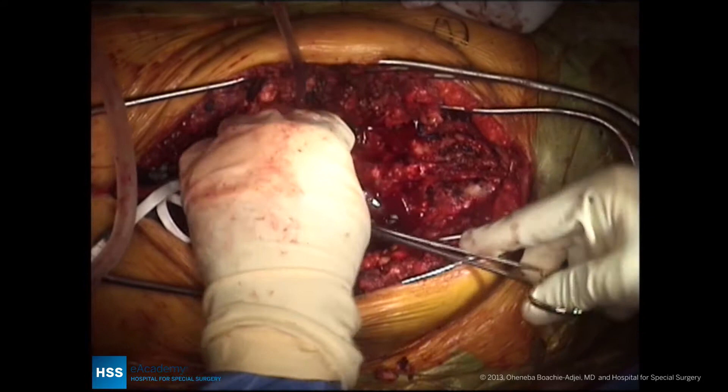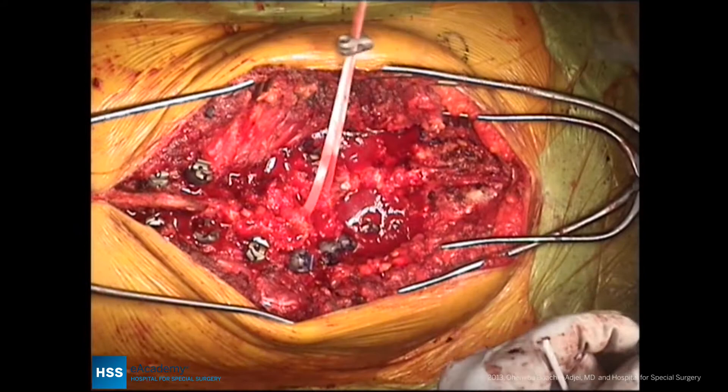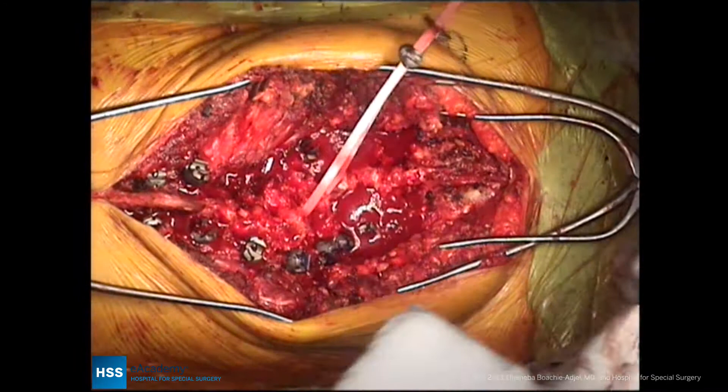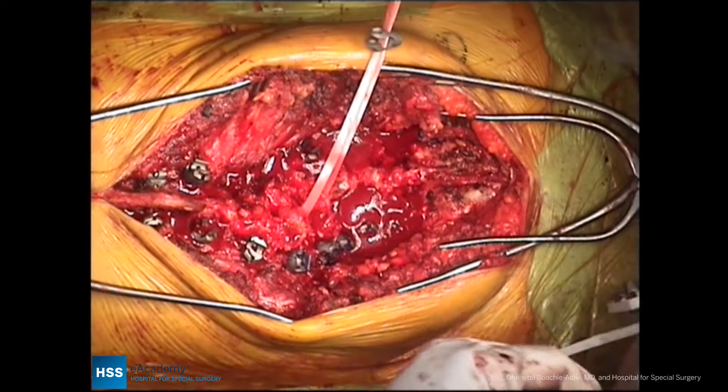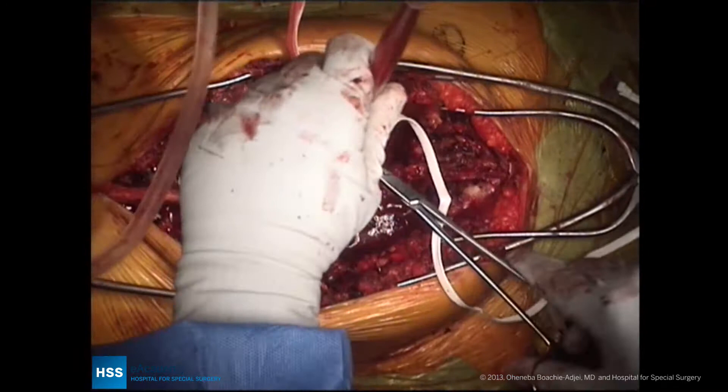Remember that in this case she had a significant coronal plane deformity, with translation to the convexity of the lumbar spine. Therefore there will be a need not just to correct the lumbar curve, which will worsen her coronal deformity, but instead to translate her trunk by shifting it to the right, towards the concavity. This is very important, and it can be best achieved with coronal plane translation, and the universal clamps do a very good job in doing this.